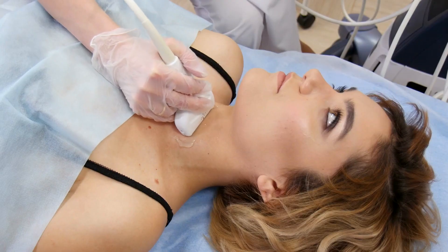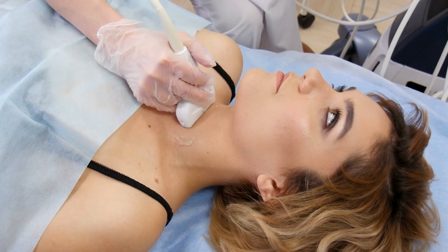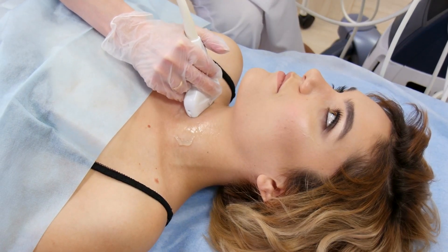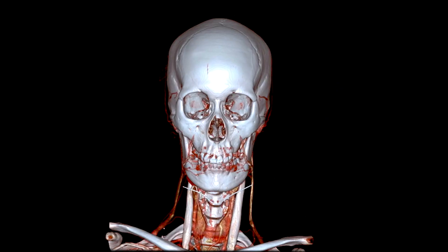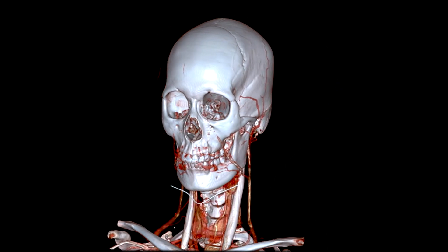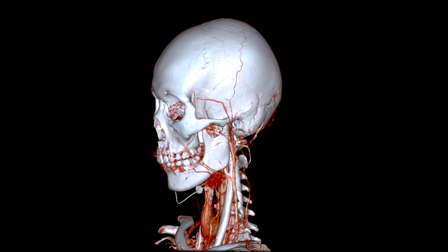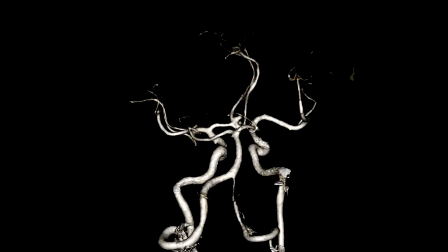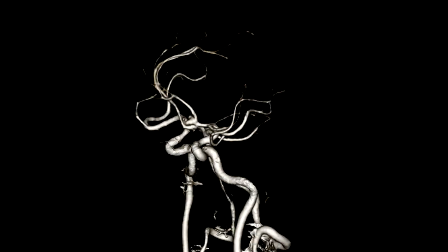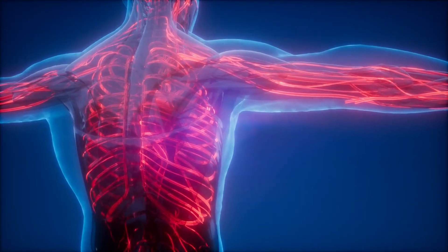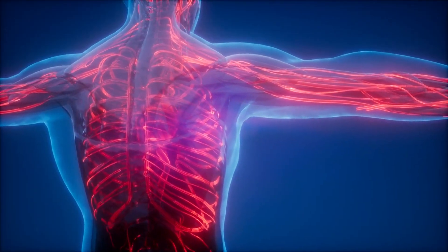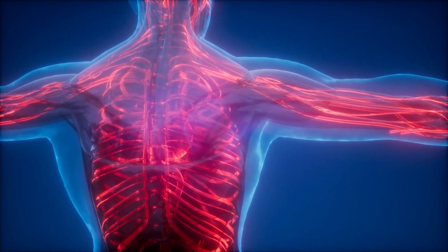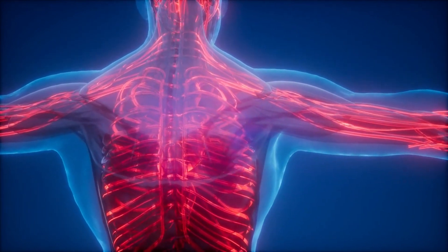Using ultrasound guidance, the vascular surgeon makes a small incision in the neck, typically near the collarbone. Through this incision, a sheath is inserted directly into the carotid artery. A specialized system known as the Enroute Transcarotid Neuroprotection System is employed to temporarily reverse blood flow away from the brain, using a unique device called a flow reversal balloon that is inserted through the sheath and positioned in the carotid artery.